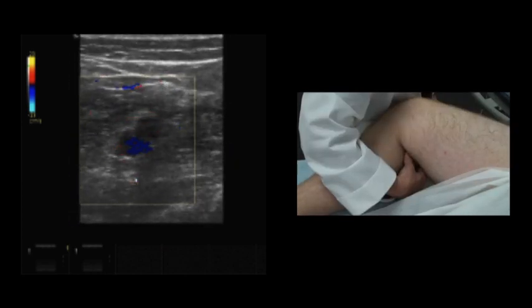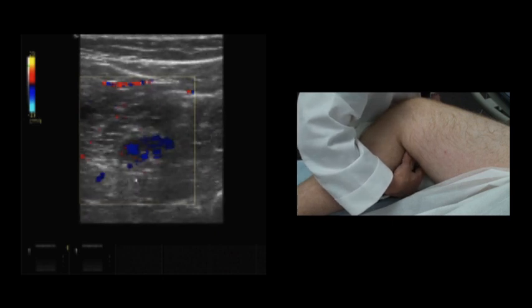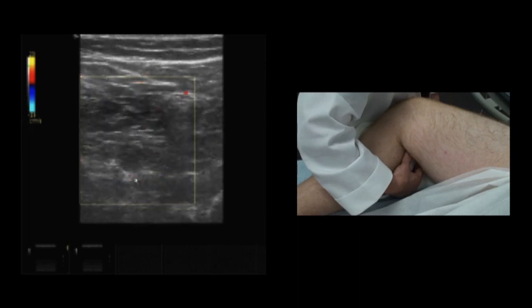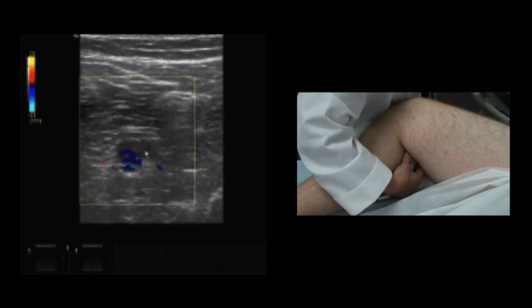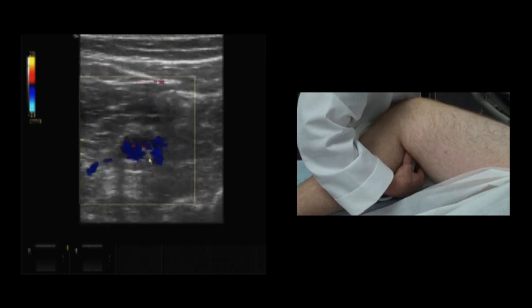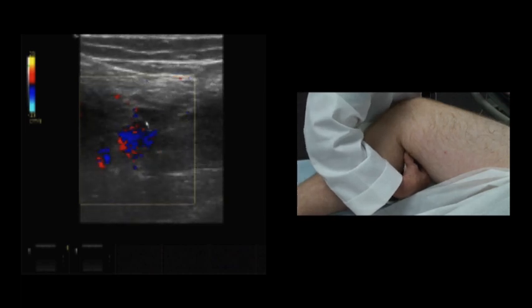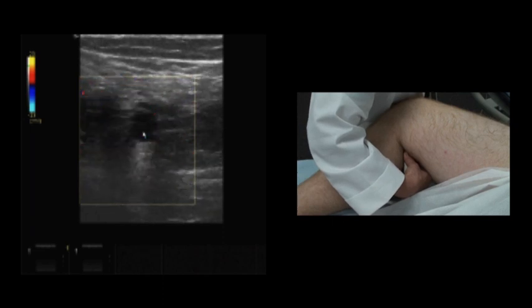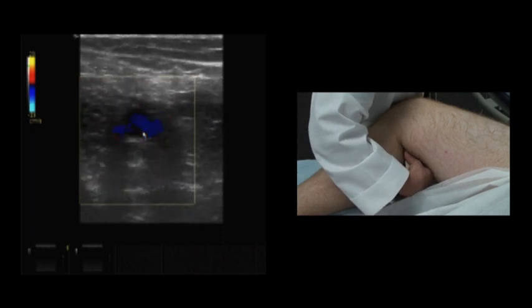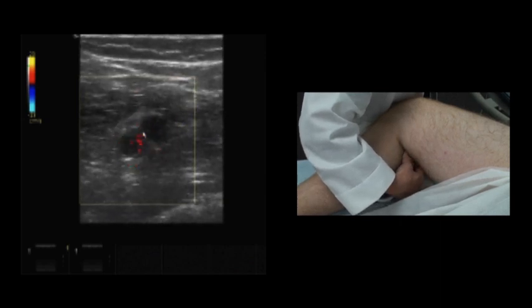Okay, I'm at the level of the popliteal fossa and in a transverse orientation, and remember the notch is pointed to the right of the patient. I'm scanning a little superiorly, and we see the superficial femoral artery and the superficial femoral vein, and they overlap. We can tell when we start to move into the popliteal fossa when the popliteal vein becomes more superficial, and here we have the popliteal artery. Scanning back superiorly and noting that there is good color filling.